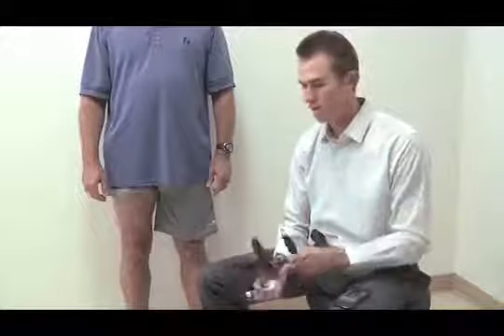Today we're going to show you how to correctly measure for an Össur custom brace. The four tools you're going to need are the SmartMeasure app on your iPhone, a marker for marking your anatomical landmarks, a measuring tape, and your constant force caliper tool.